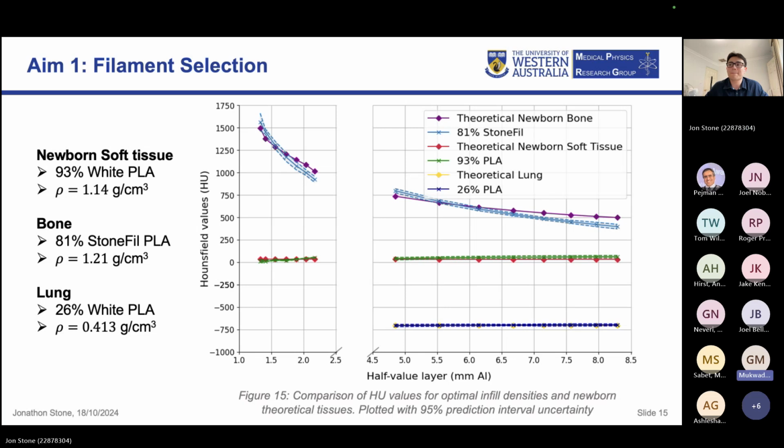Okay, so what do you think could be the limitation of just using the HU numbers? Well, I guess the limitation is the fact that it doesn't perfectly tell you the scattering and mass attenuation coefficient characteristics. So, especially in high energy dosimetry where charged particle equilibrium is important, I think that's a limitation. Okay.